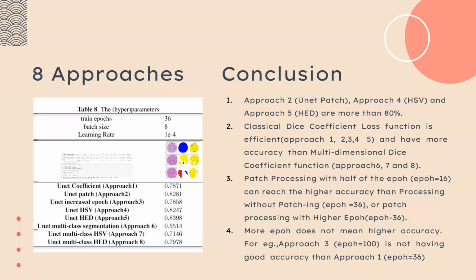Before we get into that, I will let my project teammate Zhang go through the approaches and the demo. Please, Zhang. Hi, yes. So we tried different models, one is DeepLab V3 and the other is UNET. Due to the low computation power, we chose the UNET with MobileNet V2.